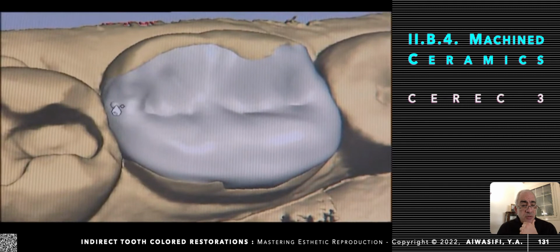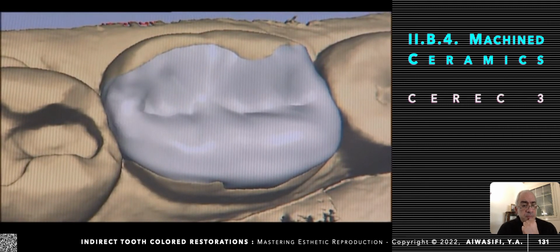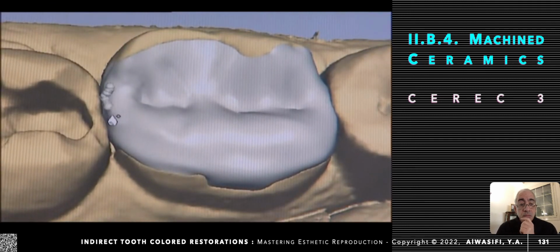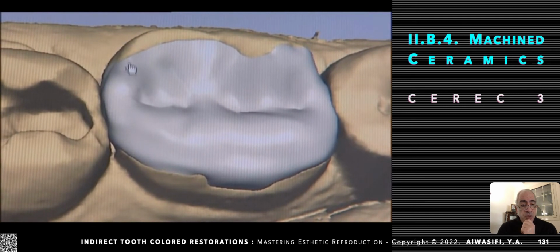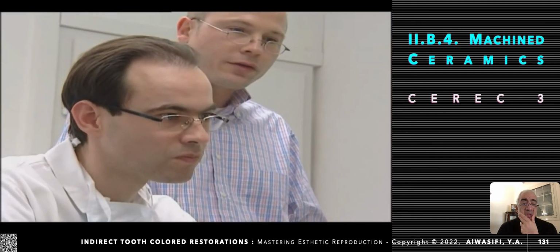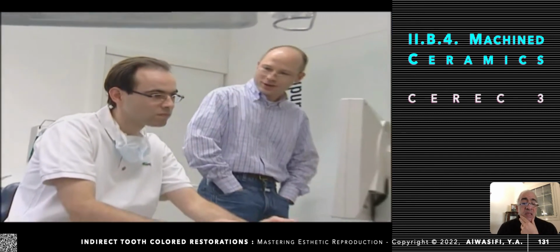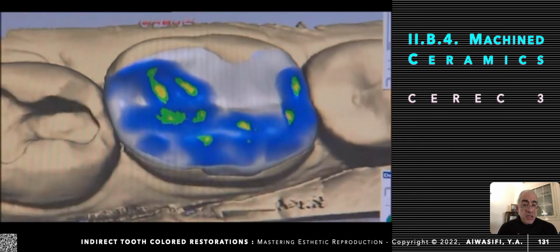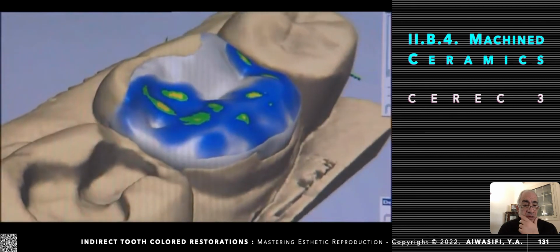It is similar to building a wax pattern. Correcting the height and the roundness of the marginal ridge. Okay, this is only to ensure that it is a one-visit technique, taking just a few minutes.